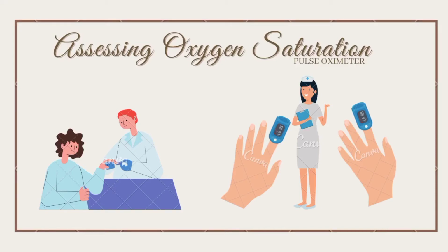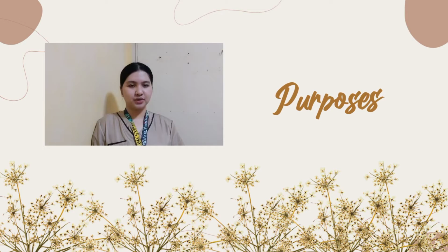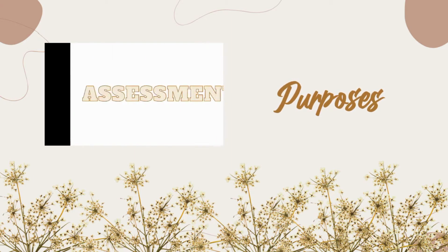We're going to demonstrate the assessing of oxygen saturation. The purpose of this procedure is to estimate the arterial blood oxygen saturation of a patient and to detect the presence of hypoxemia before visible signs develop.